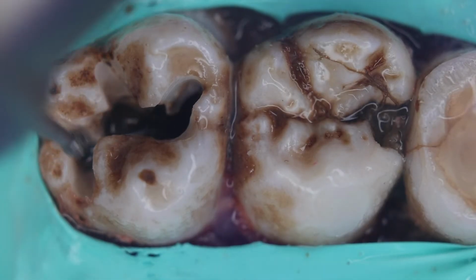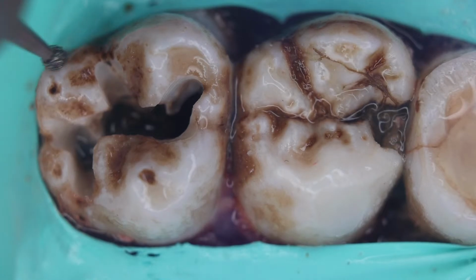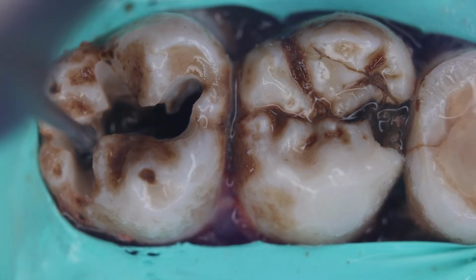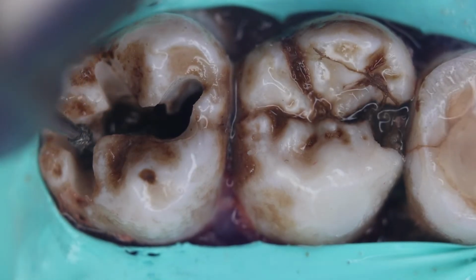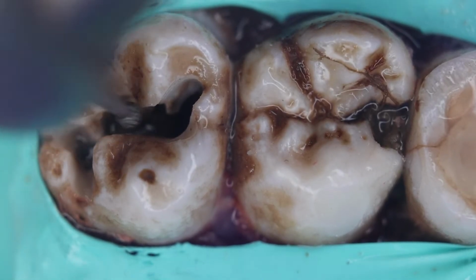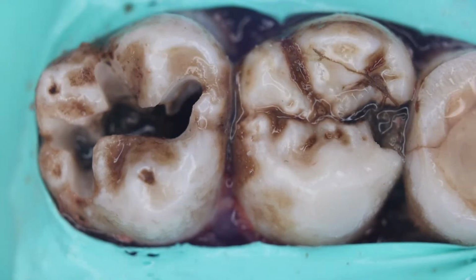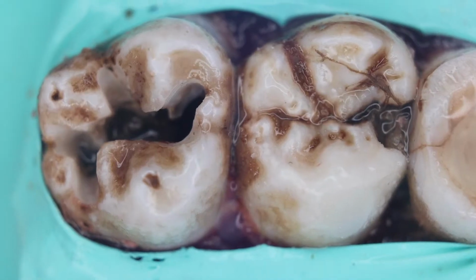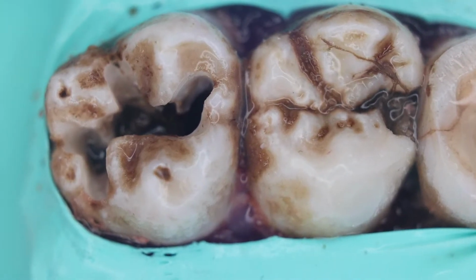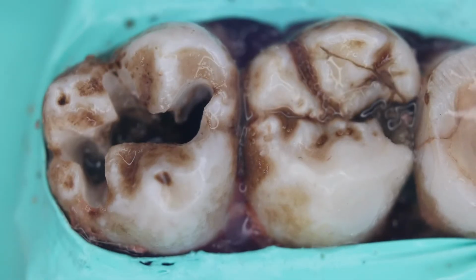And we can still see the caries. There are some stains over there, so we can consider cleaning them. But there are caries. That is the most crucial step or the approach that we should be following, that we should be removing all the caries. And now is the time to switch to a big round burr to form the outline form and the initial depth.